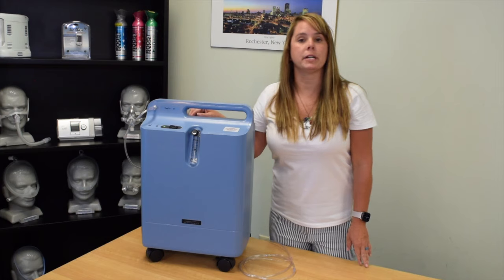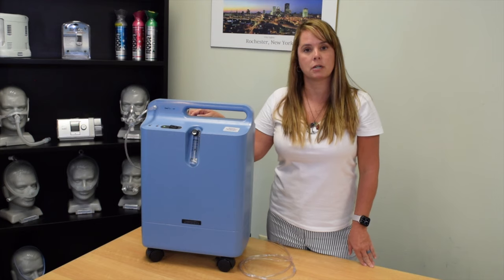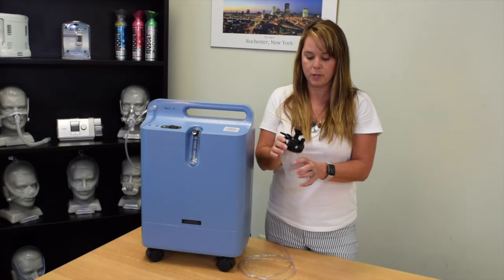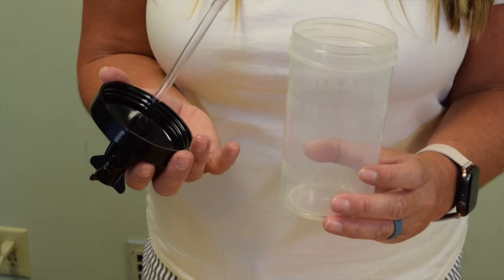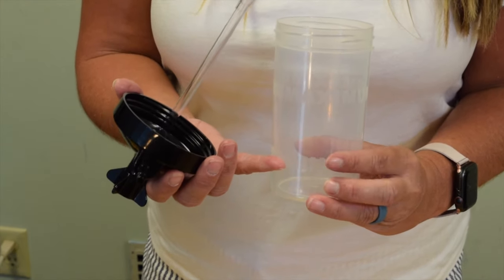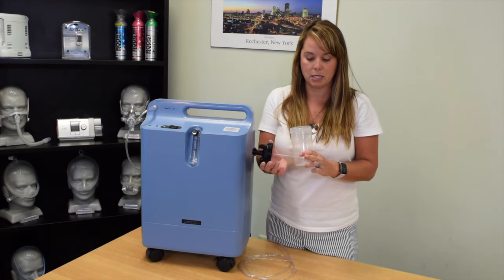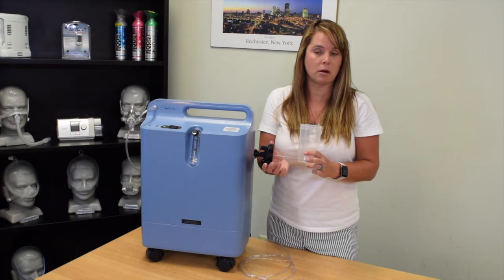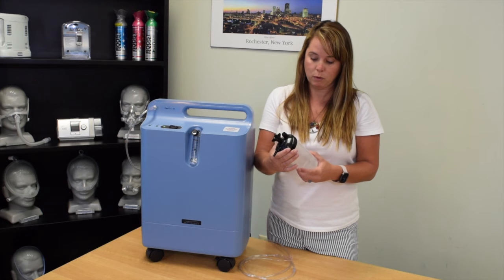The third issue you may experience is if you're using a humidifier bottle. Some patients require humidity with the oxygen because it can be very drying to their sinus passages. This is what our humidifier bottle looks like — there are two pieces: the lid with the bubbler and the actual container that we fill. Distilled water only, with a max line at the top and a minimum line at the bottom. If you use tap water instead of distilled, the bubbler will get clogged with minerals and you won't actually be receiving any humidification.